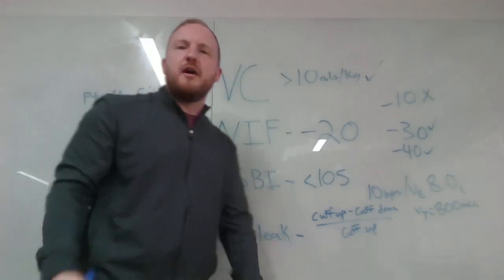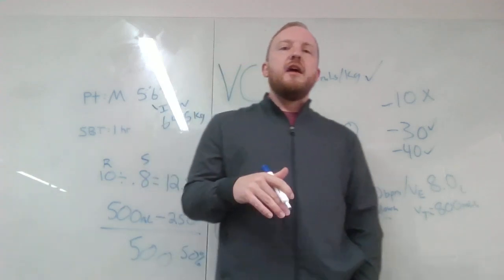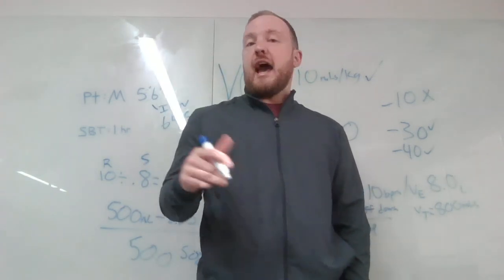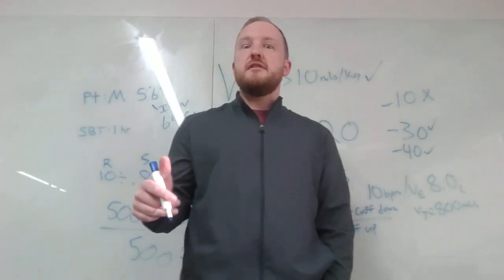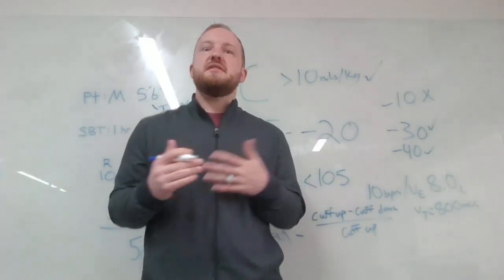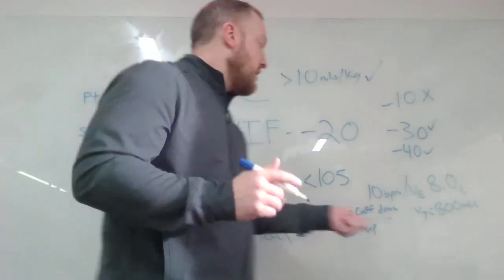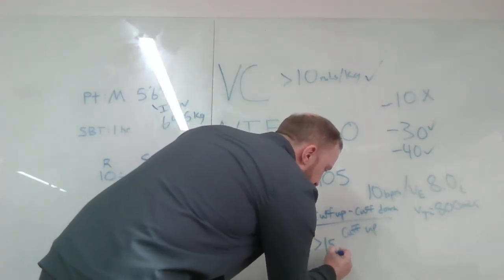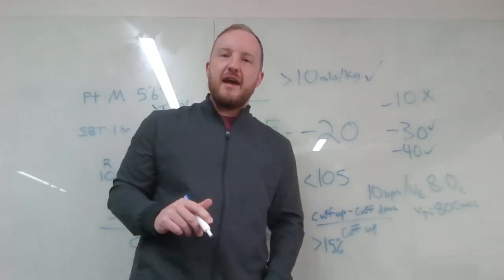Now, what's a normal cuff leak? Like I said, in these tests, every hospital I've worked at is a little different. If it says an audible cuff leak, we're happy with it. If it says absence of cuff leak, or no cuff leak is heard, that's a no-go. We're not going to extubate our patient. That's unsafe. Recommend some steroids or something, and we're going to try again tomorrow. But from where I've worked, as long as that cuff leak is greater than 15%, we're happy with that, and we're going to move forward with the extubation.